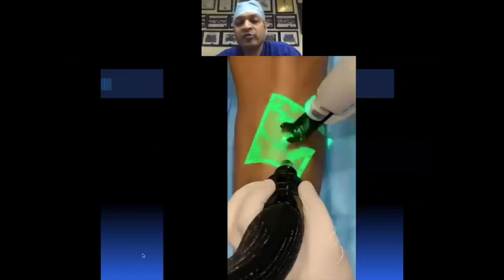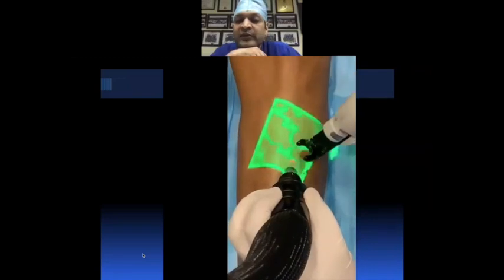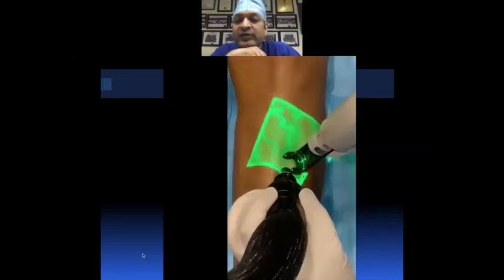And this is a small video. You can see how the veins get illuminated with an infrared. We are using a 6 mm spot over here with a pulse duration of 15 to 30 milliseconds. You can use it depending on the size of the vein. You can also use the heat energy, around 40 to 80 joules. We can use the fluence in this to burn the vein.